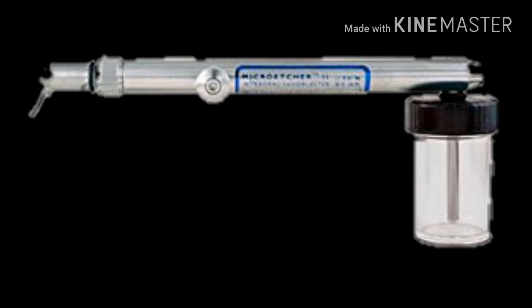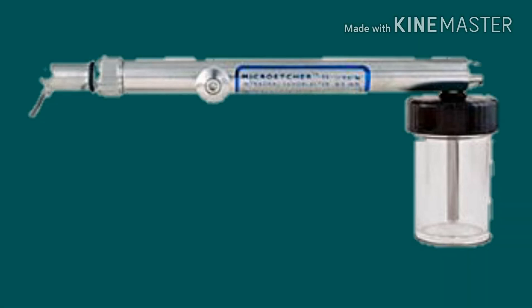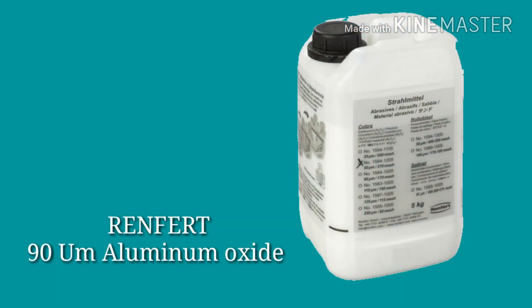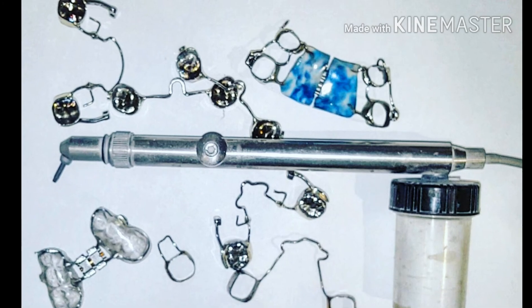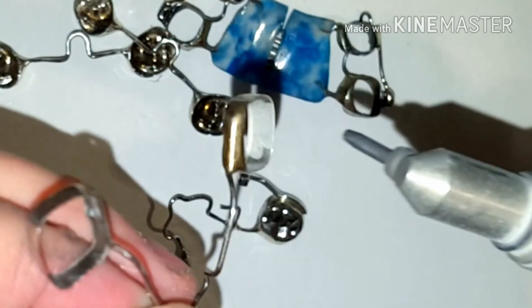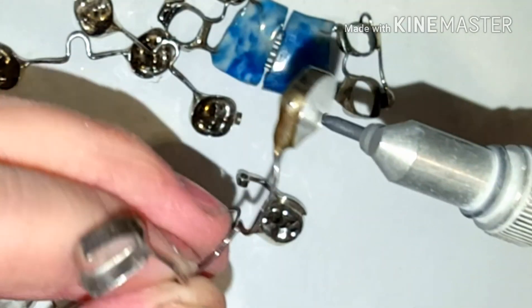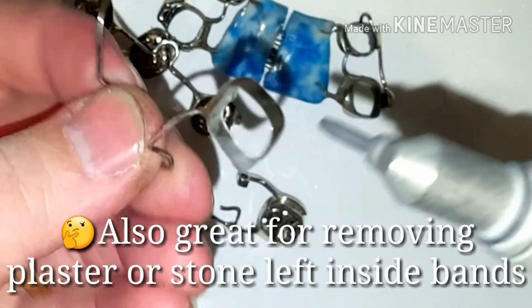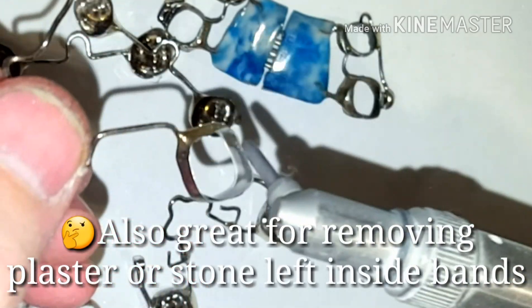Hi, this is Steve Zara from Zara Dental Lab, and this is an orthodontic video showing you how I micro-etch my bands and crowns. In this video, I specifically picked out five different appliances that I typically micro-etch before I send them out to my doctors. The micro-etching really helps with the adherence of the cements and glues that help bond the appliances to the patient's mouth.